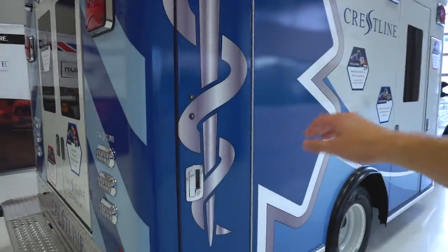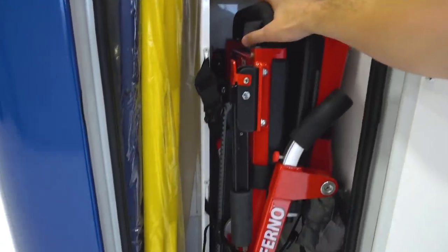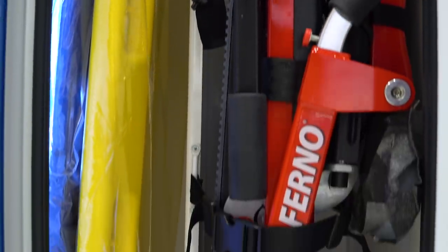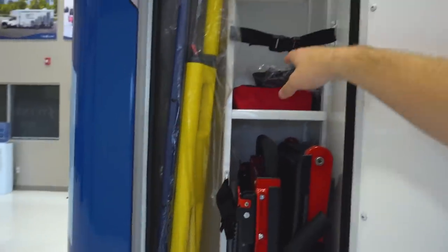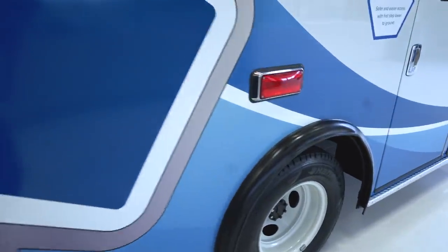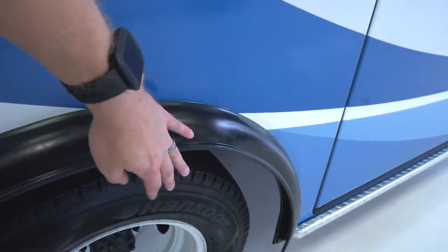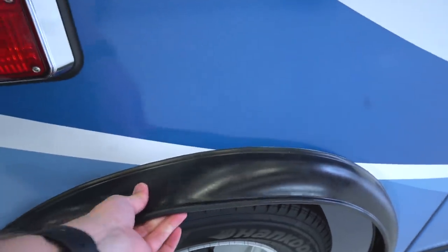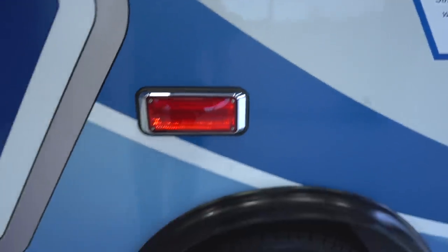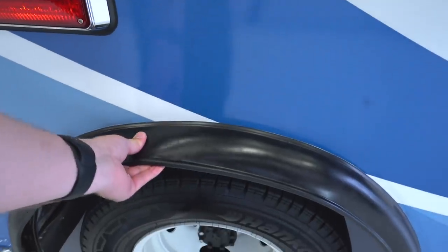Coming around to this side of the rig, in this cabinet you've got your stair chair area — this is a Ferno stair chair, it's absolutely massive and fits in here no problem. You've got your scoop boards, split boards, and backboards without any difficulty, and up in here room for straps and C-collars. Over the wheel well, you have this rubber piece. A lot of rigs run around with chrome versions that get bent and misshapen after a short period of time, but this one has a really strong rubber material that's super easy to replace — your maintenance guys can just order the part and put it on in minutes.